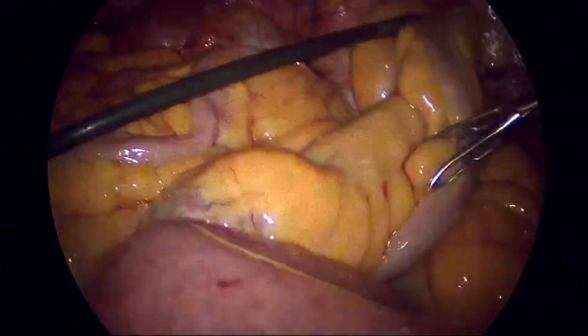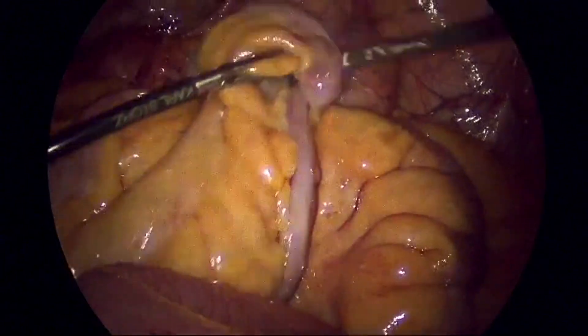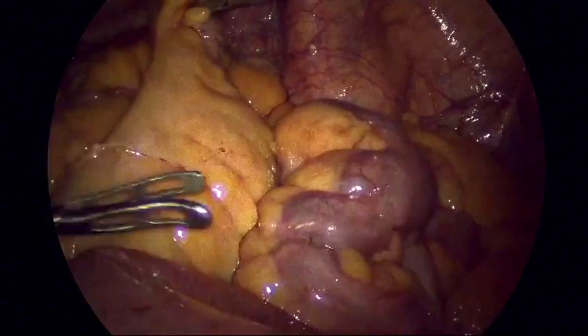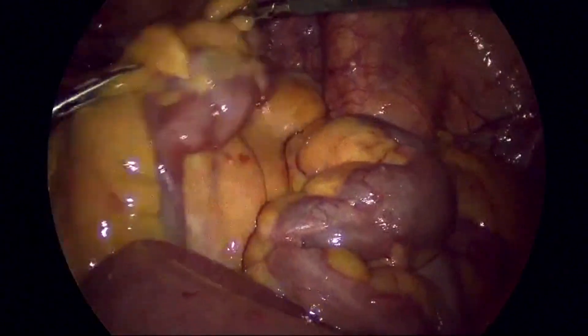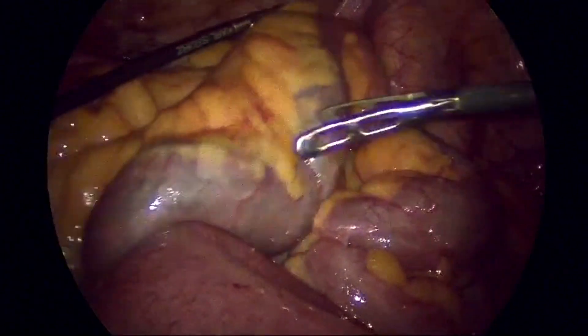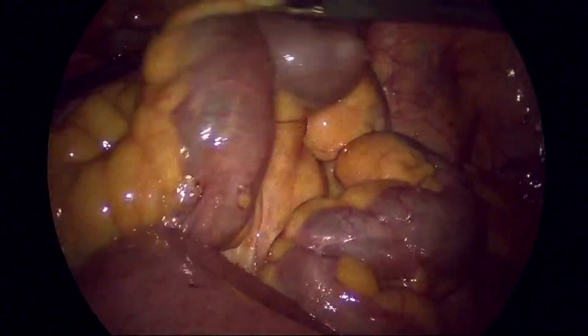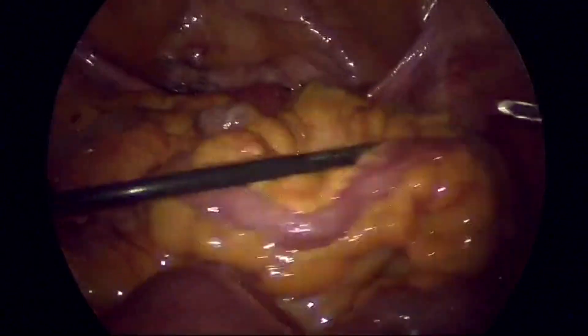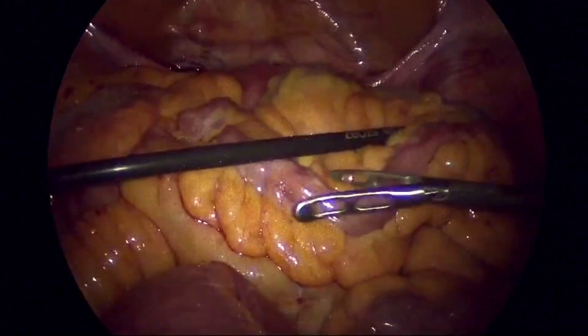With this tuberculosis being present, you can see the multiple nodules here. You might have to do a stoma in these patients with active tuberculosis if you injure the bowel.